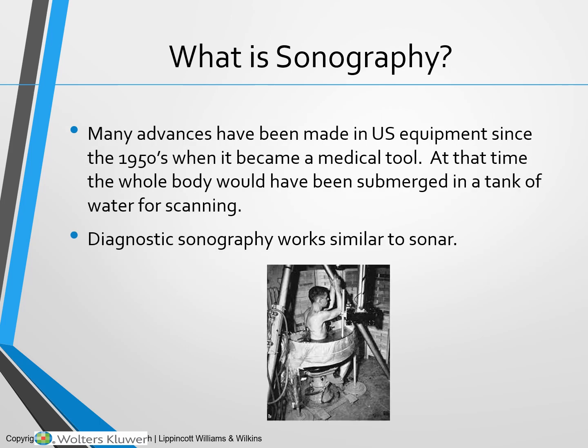Many advances have been made in ultrasound equipment since the 1950s when it first became a medical diagnostic tool. At that time, the entire body of a patient would have been submerged in a tank of water for scanning. Below, you can see an image of an early ultrasound machine, and we have definitely come a long way since that time. Diagnostic sonography works very similar to sonar.